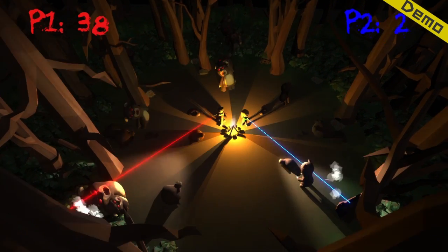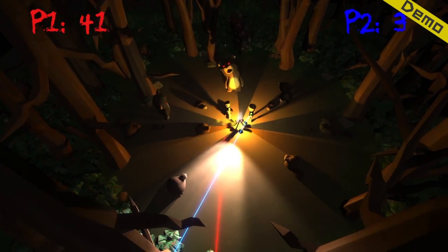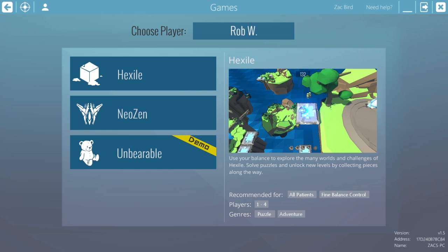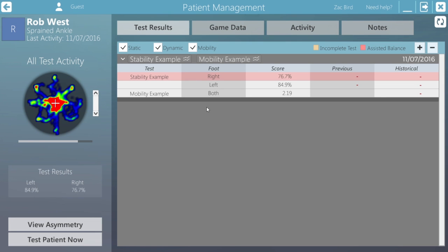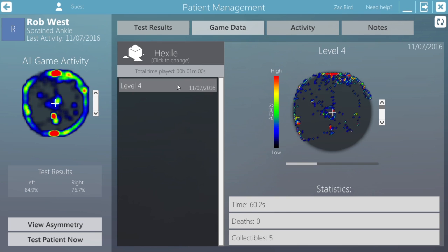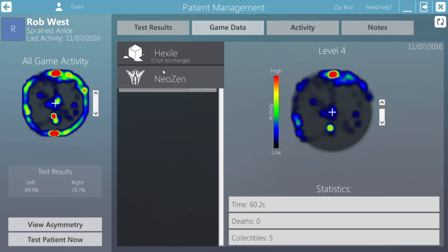Unbearable is still in development, but we'd love to hear your feedback on the demo included. Each time a game is played, data is saved to the patient's account. You can view the data by returning to the home screen, clicking on the patient's account, and selecting the Game Data tab. For each level played, the scores and an activity map which shows their balance while playing is saved.